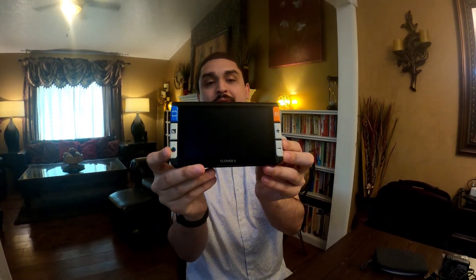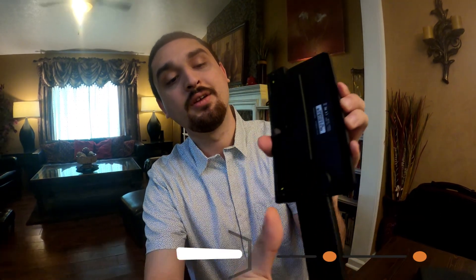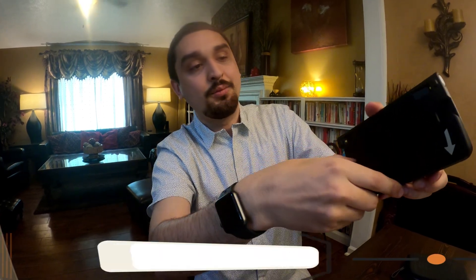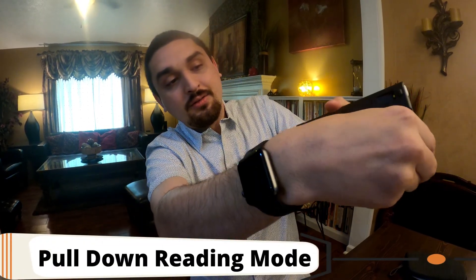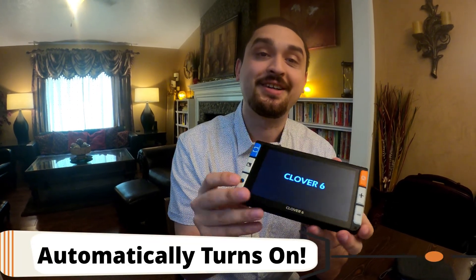Inside we have the video magnifier, and what I like about it is on the back this handle is attached and just easily rotates in and out. It has a nice felt fabric piece here so you're not going to scratch the back of the device. If you pull it down it goes into a reading mode, which apparently also turns the device on automatically — I just discovered that.